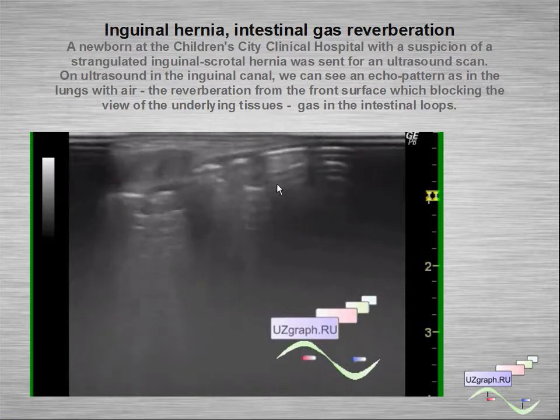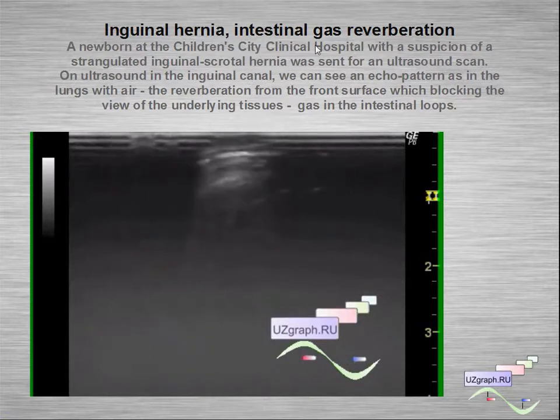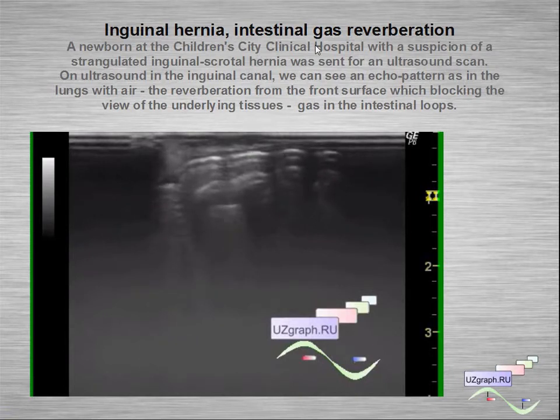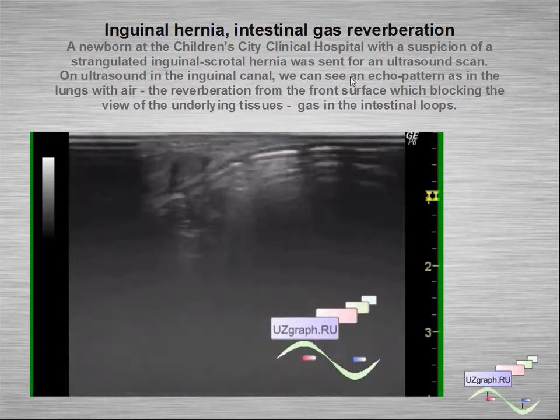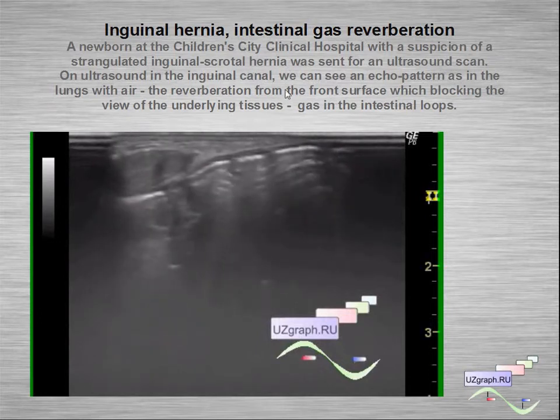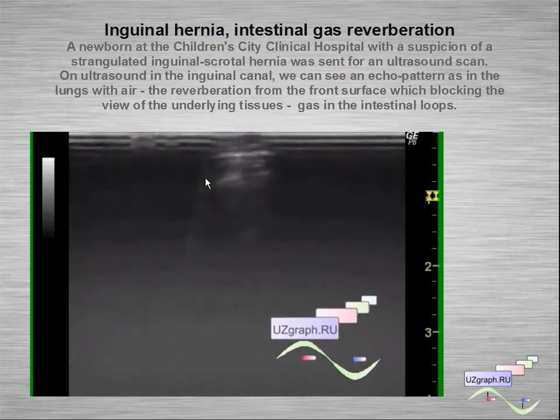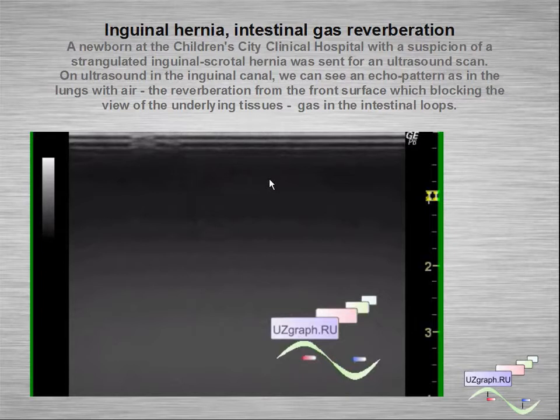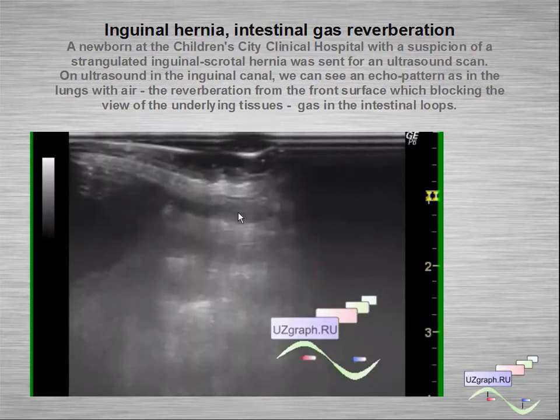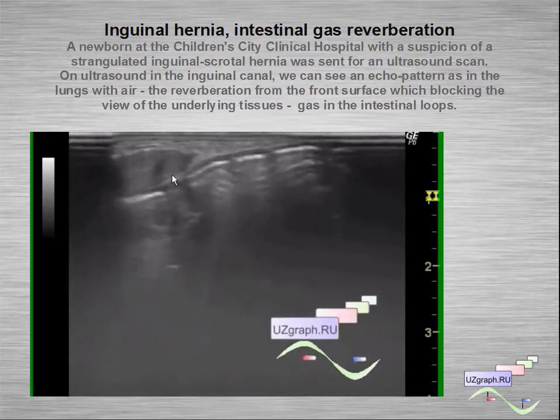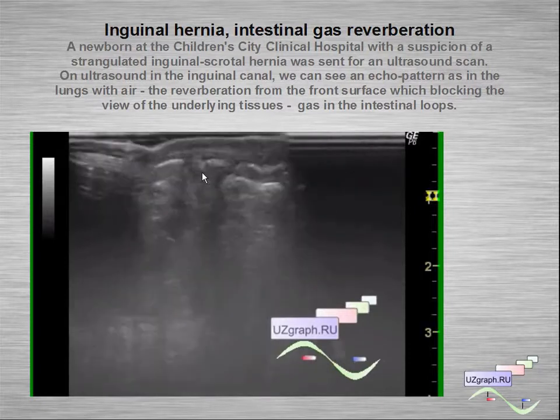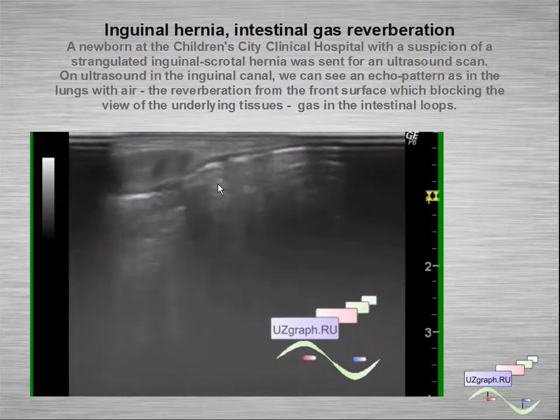In another case, this is inguinal hernia with intestinal gas — a reverberation effect. A newborn with suspicion of strangulating hernia was sent for ultrasound, and we can see the echo pattern of reverberation like a lung echo pattern. We can see the testicle and intestine in the inguinal canal with gas.